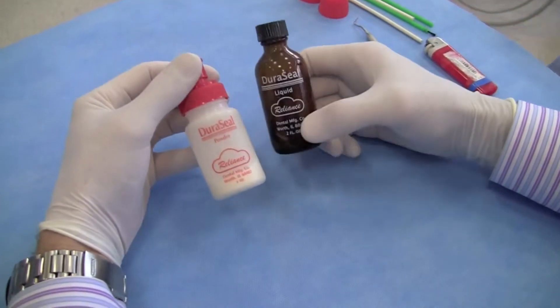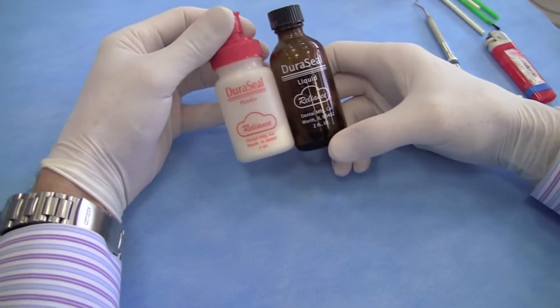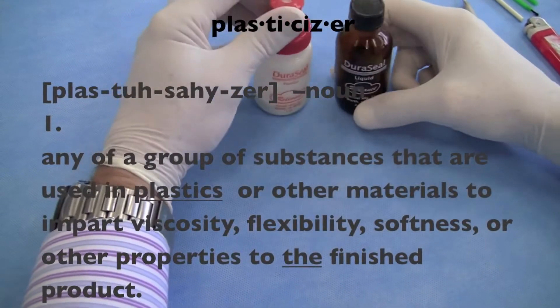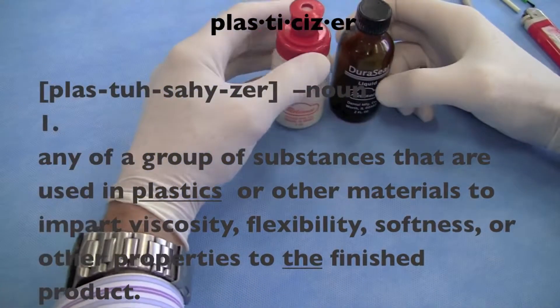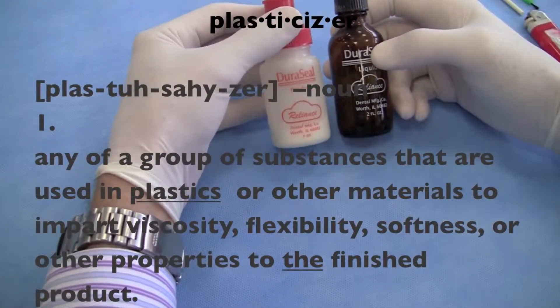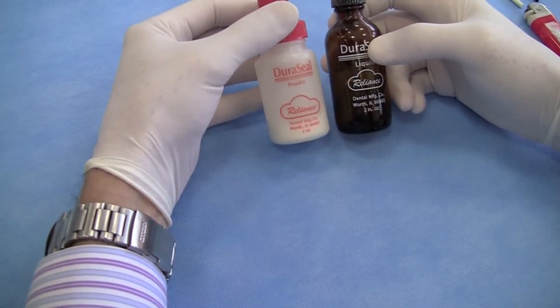The product is called Duraceal, and it's made by Reliance — the same company that makes Duralay, which is often used for patterns. Duraceal is basically a polymethylmethacrylate with plasticizers. When you mix the liquid and powder together, you get a typical setting reaction like any PMMA, but the product will never achieve a full hard set. It stays somewhat rubbery, which is to our advantage for removing the temporary.